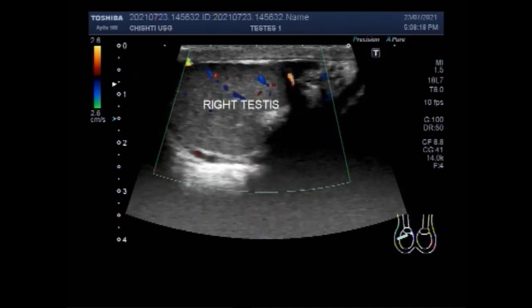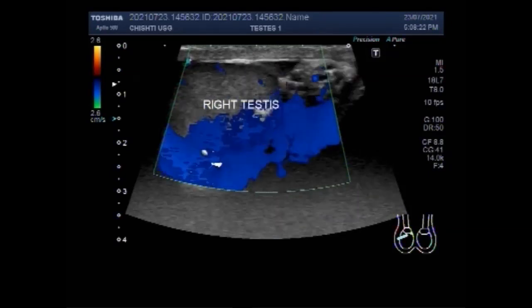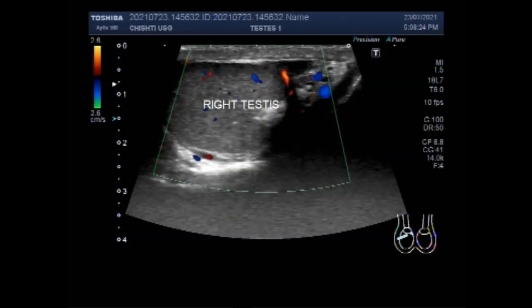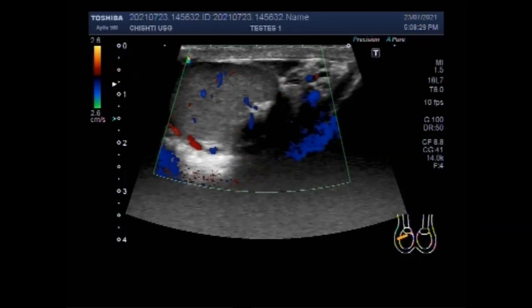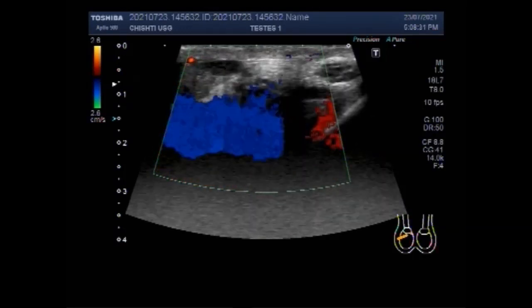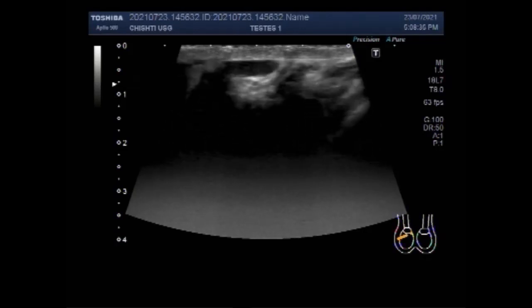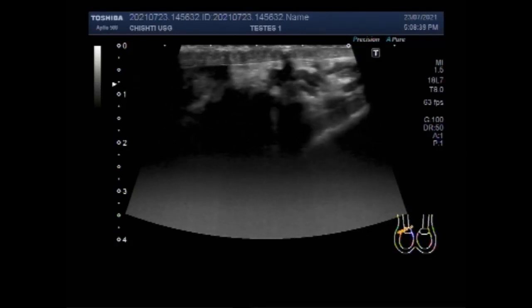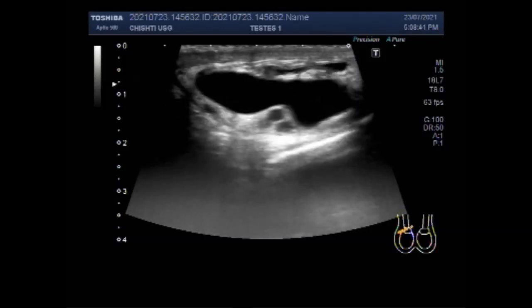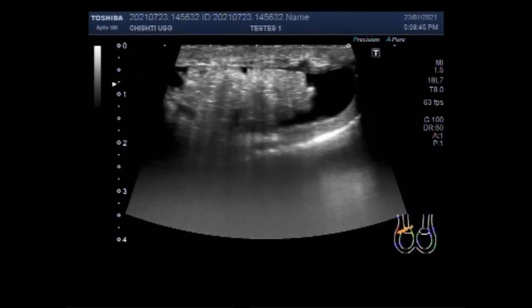Ultrasound is a non-invasive, non-ionizing radiation modality which is highly successful at soft tissue imaging. Groin pain from an occult hernia can be a difficult clinical diagnosis, made easy by good imaging, by optimizing the image using depth, focus, and gain. Now you can see the ultrasound findings.